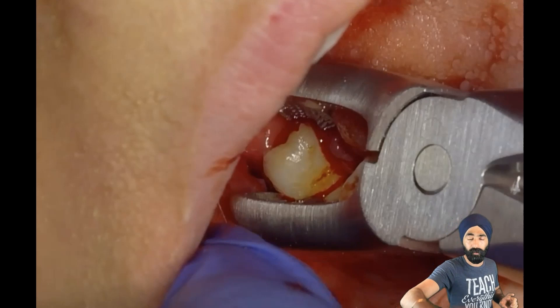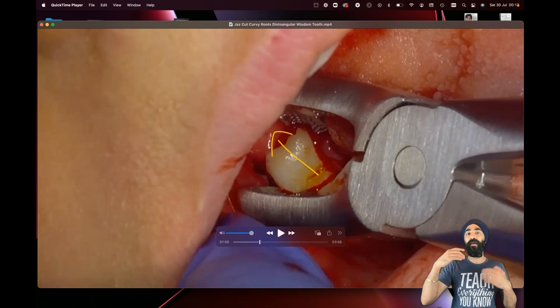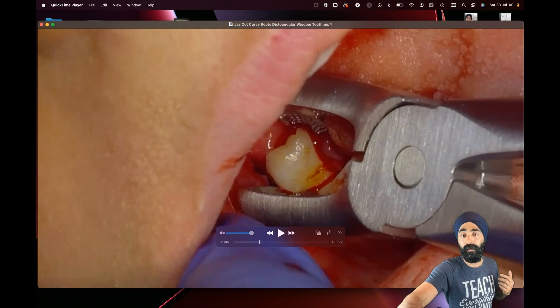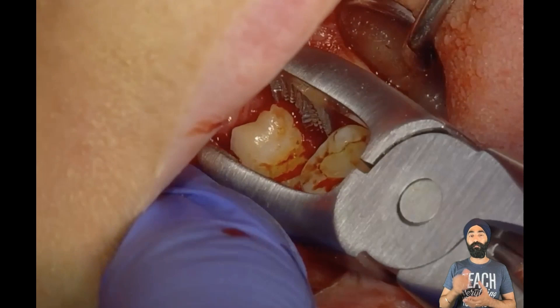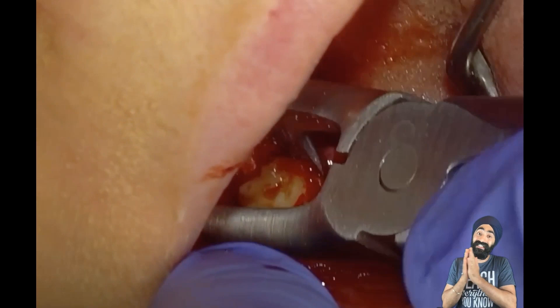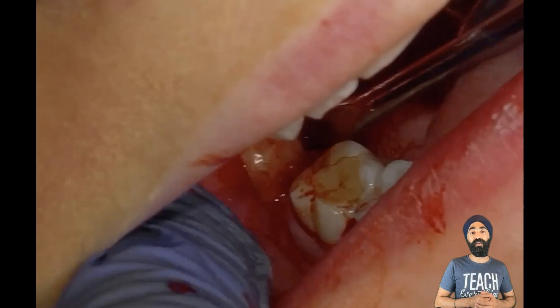Because it is disto-angular, the tooth wants to come out in a distal direction. I try getting the forceps on — knowing about that curve it was a bit ambitious, but I wanted to get some movement. I do some buccolingual rotations, figure of eight, but it's not budging; it's pretty solid. So eventually I decide I need to do more sectioning because it's still impacted by the soft tissue and the ramus distally — it's not going to come out. So we get the burr again and start sectioning.